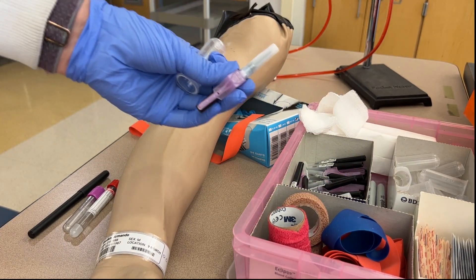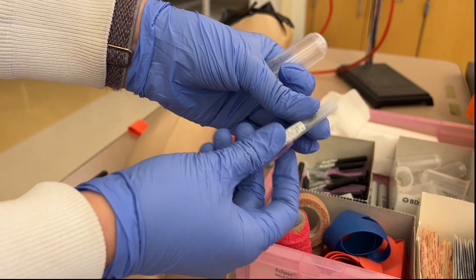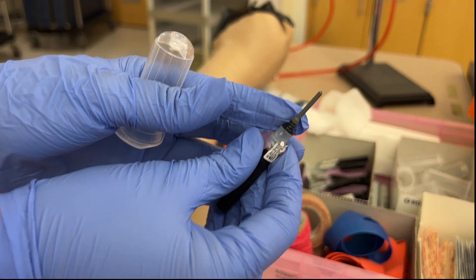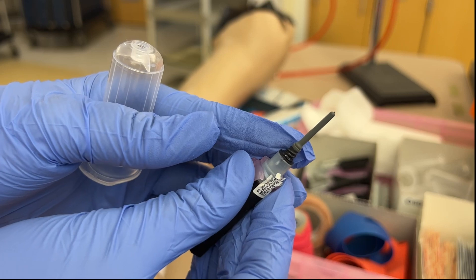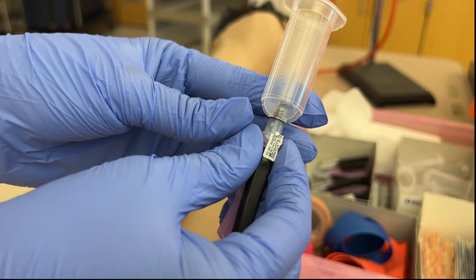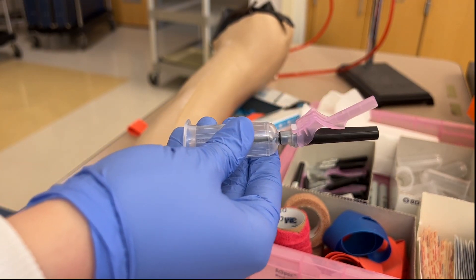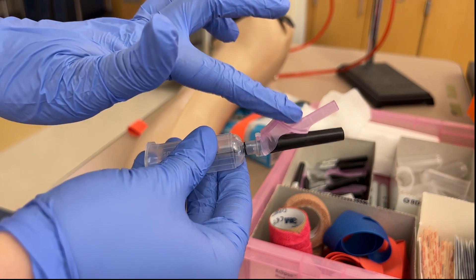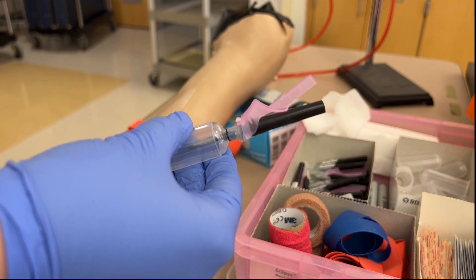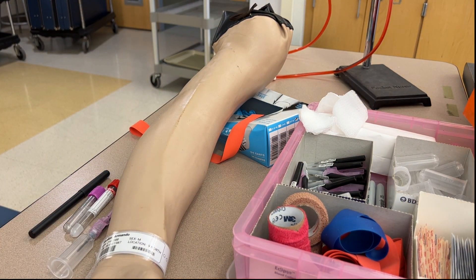This patient had very large veins so we can use a straight tube holder. To assemble this, take the needle assembly and tube holder, remove the needle cap by twisting to break the paper seal and discard that piece. You can see a silicone sheath covering a needle that will puncture the vacutainer tubes. Twist the needle into the tube holder until finger tight. This apparatus is held between your thumb and fingers like a remote control, held loosely. There's a safety device — pull it back so the bevel faces up. Keep your thumb under the safety device so you can activate it once the needle is out of the patient's arm.